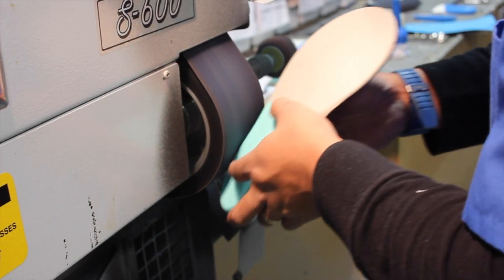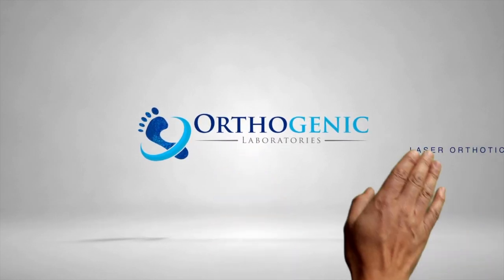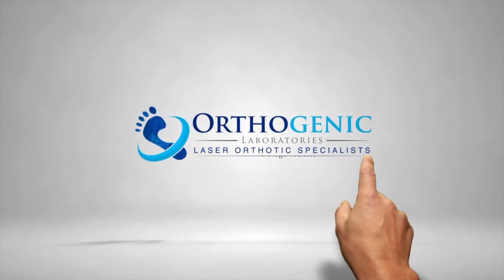What you will get is a complete solution for your orthotic practice, both clinically tested and insurance approved. Get your Orthogenic scanner today and experience the true freedom of mobile 3D scanning.